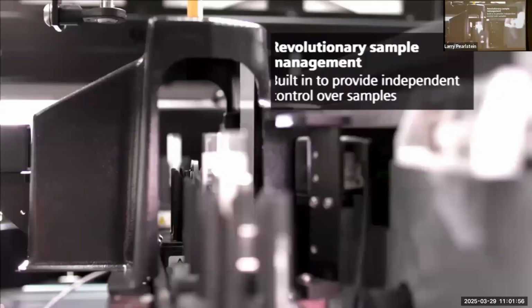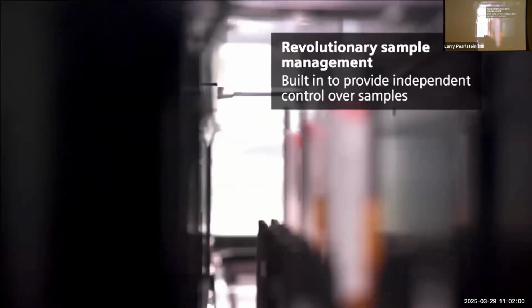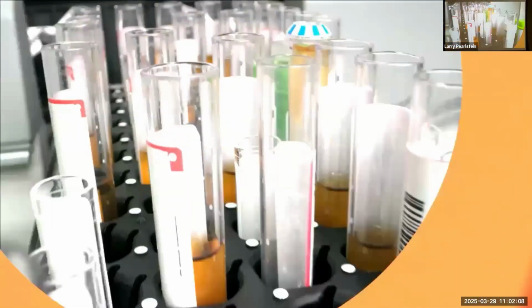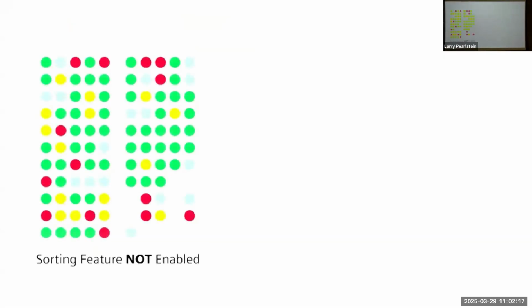You can see there are the samples being moved along. And here sorting and archiving samples. And there again, you can see the sample mover.